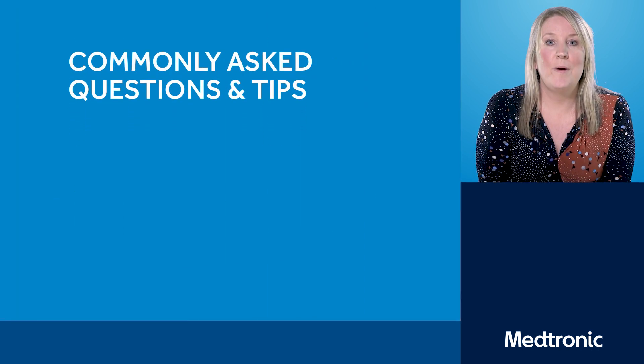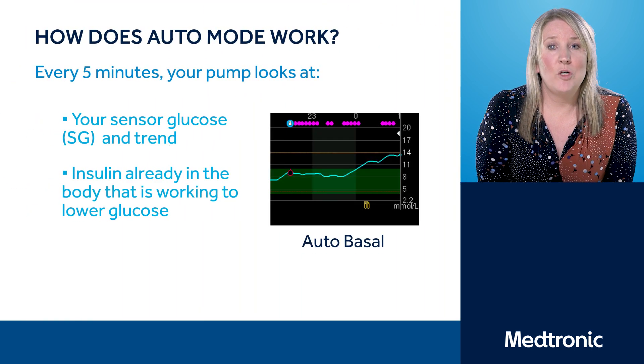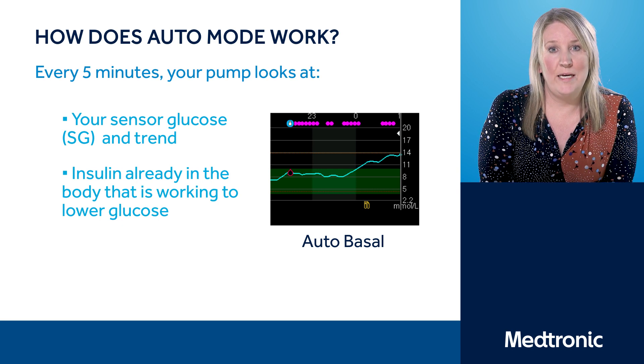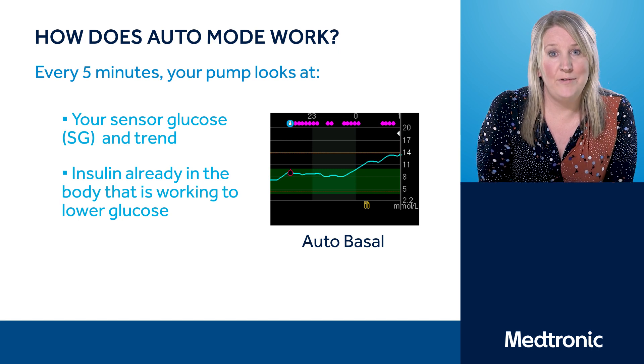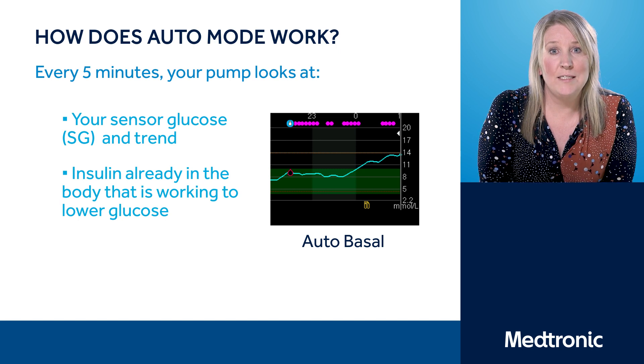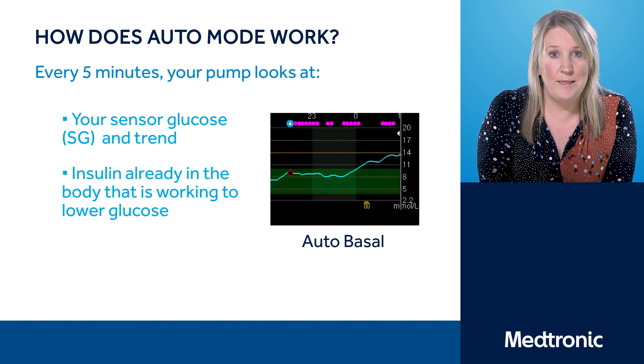So how does Auto Mode work? Auto Mode is calculating your body's insulin requirements every 5 minutes — this is what we call Auto Basal — and you can see this demonstrated at the top of your pump graph with the pink dots, which show how much Auto Basal has been delivered. The pump takes into account the sensor glucose readings, along with where you are from your target and the speed at which your blood glucose levels may be rising or falling, to keep you in that target range away from hypoglycemia.